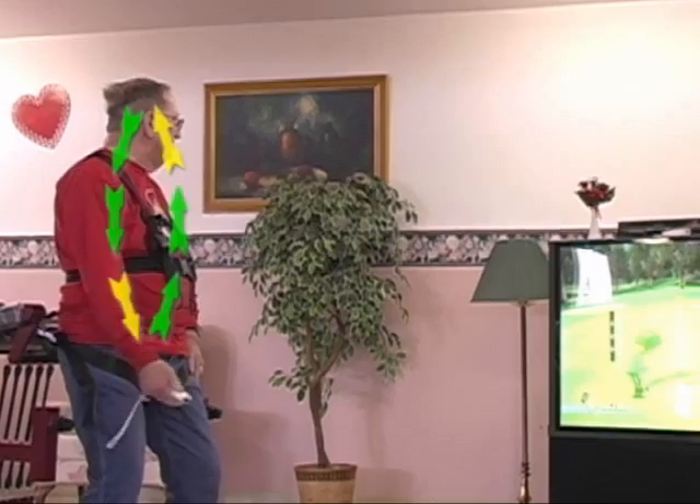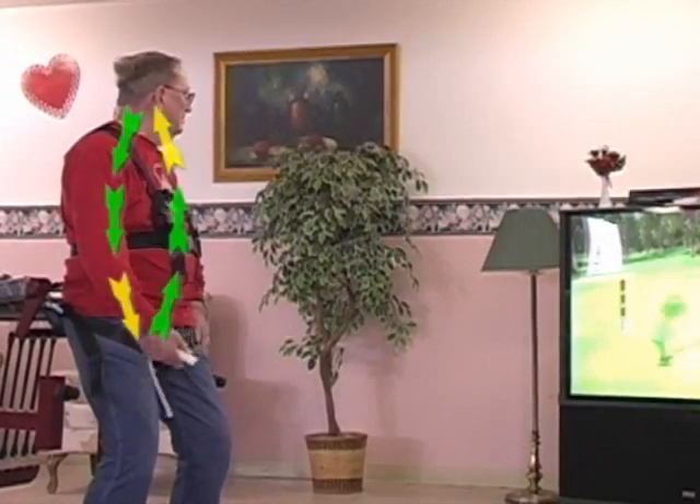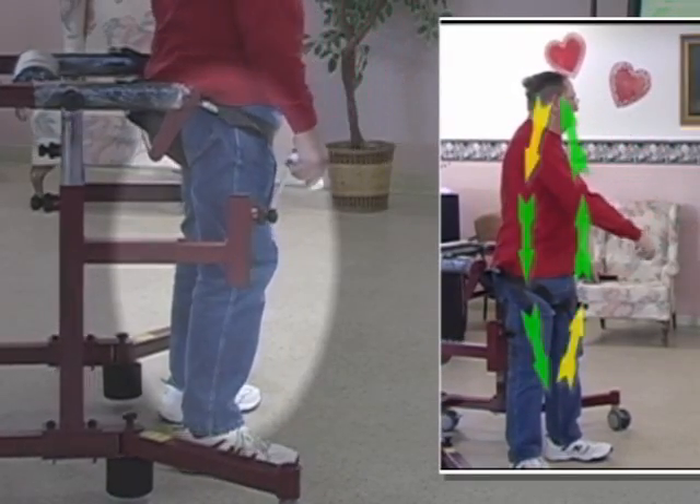For example, when playing a Wii game, the senior not only improves the control and coordination of the arms and trunk directly engaged in the act of throwing, but also the control of the leg supporting the swing and hence the balance.